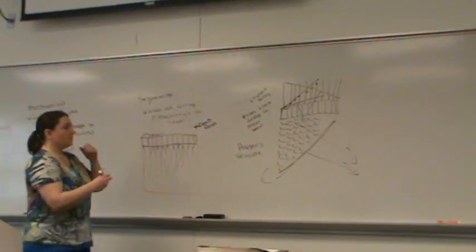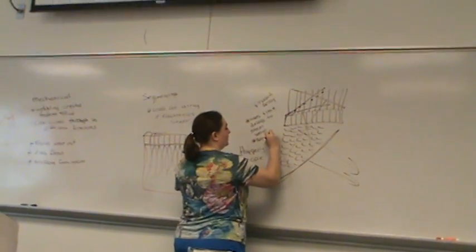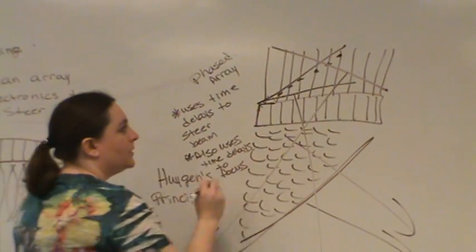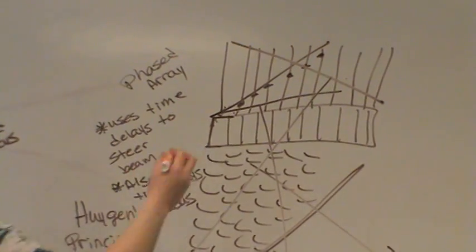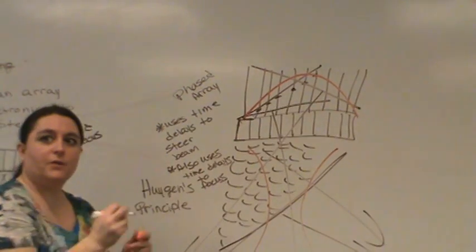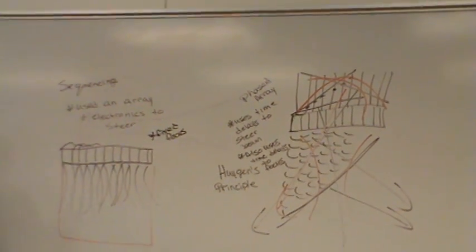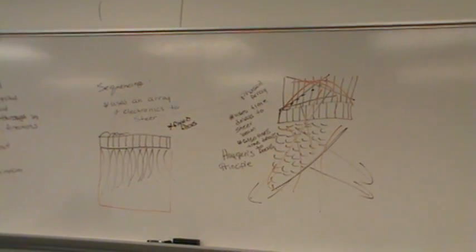Okay. We can also use these time delays to focus the beam. So if I had a curved slope, instead of these straight slopes, I'm going to add up a beam that would focus. I can put the curved effect on the straight line and have a beam that's steered and focused in all the different directions I need. So that's what a phased array does.